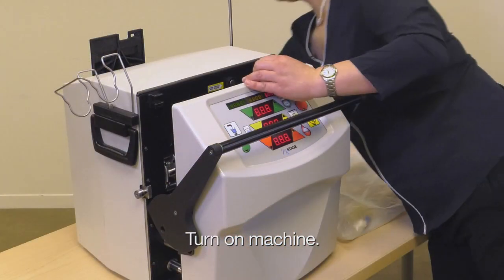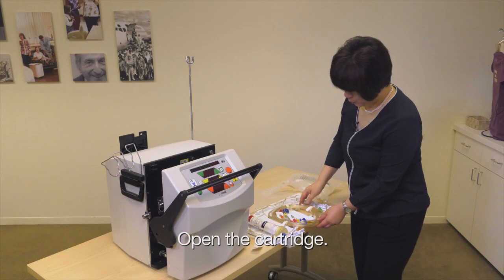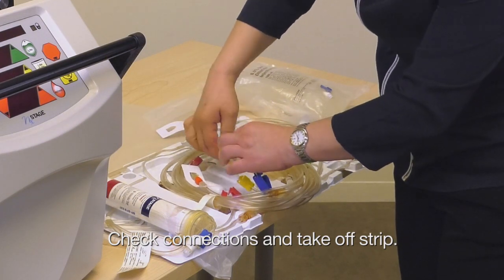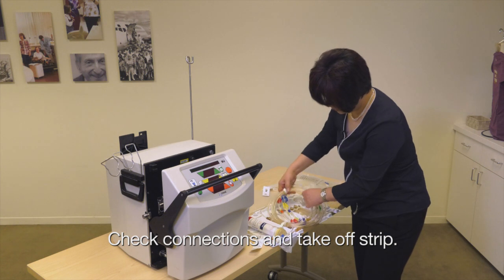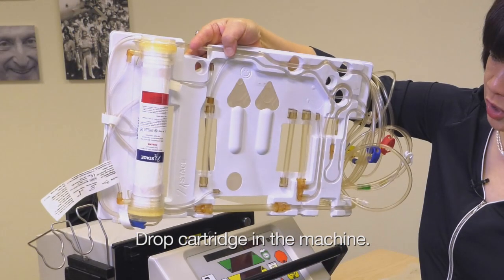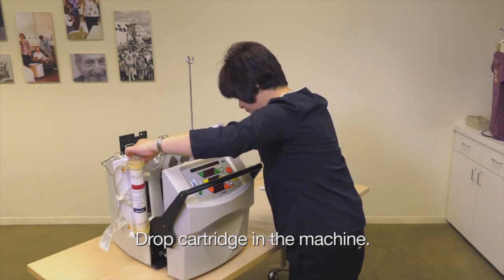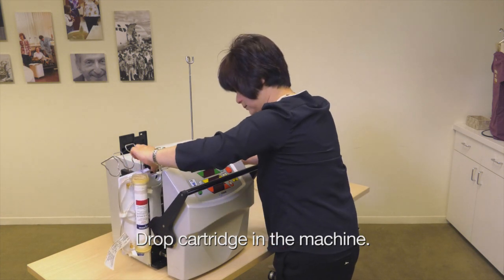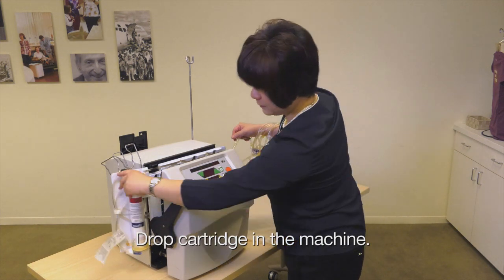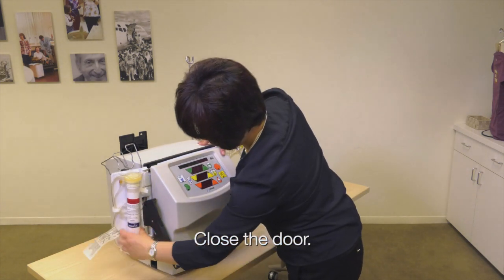First of all, we have to turn on the machine. We're going to open up the cartridge. With the cartridge, we need to make sure all the connections are intact. And then we're going to take off the strap that holds the cartridge together. Now I'm going to drop the cartridge in and then close the door, making sure nothing is pinched.